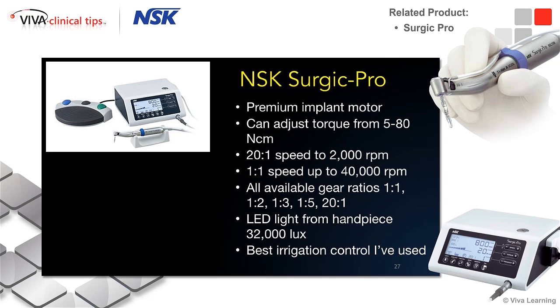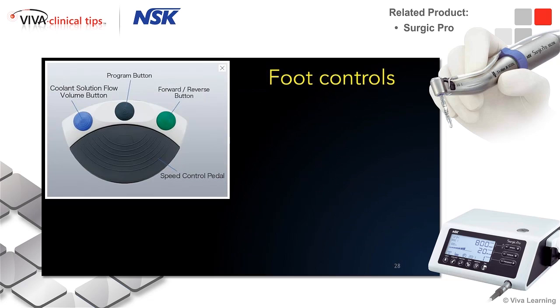One thing I really like about this is the irrigation control is really good. It has five settings from low to high, and you can change them with the touch of your foot, instead of having to squeeze down the stopper on the bag, which is how you control some of the other common implant motors. Here's the foot controls — you can control the coolant solution and the irrigation, making it go from low to high irrigation. You can change the program by tapping, and there are presets for eight different programs. I'll show you the three or four most common — you just put them in and toggle to your favorite setting.